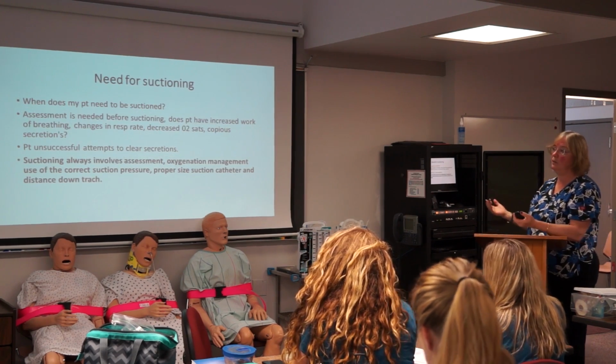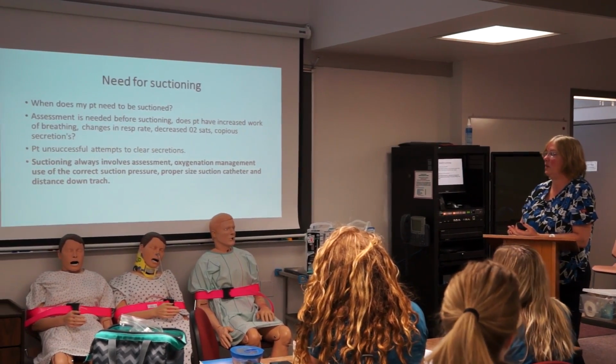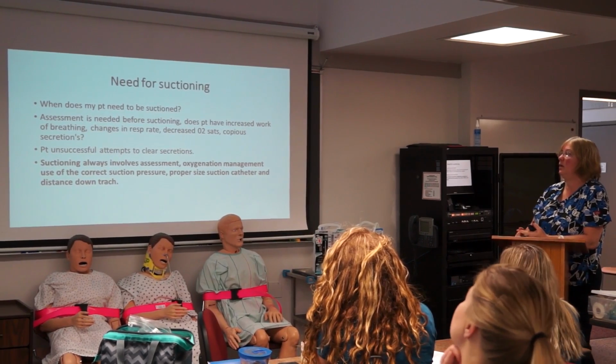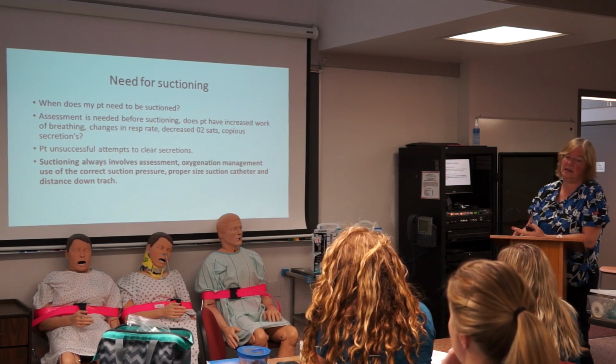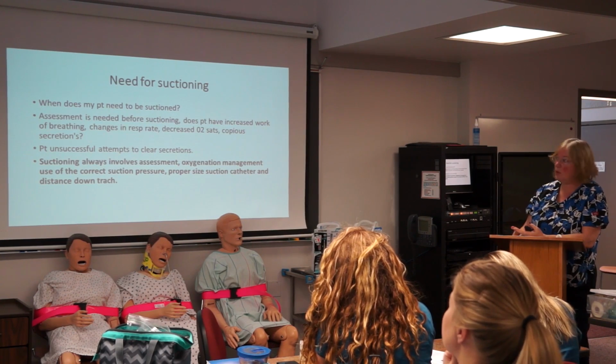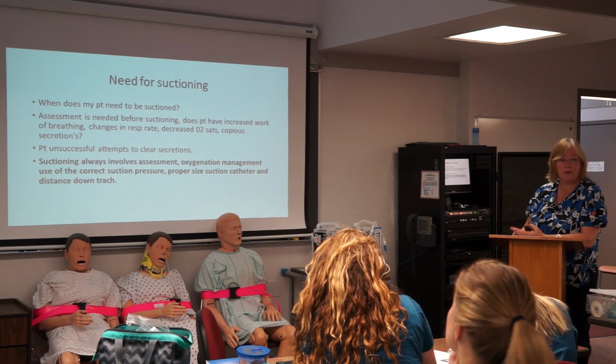Need for suctioning. When do we decide? How do we do it? We always assess our patient before suctioning. Okay. Does the patient have increased work of breathing? What's the change in the respiratory status? Is it more labored? Is it increased? Are SATs decreasing? Do they have copious secretions?